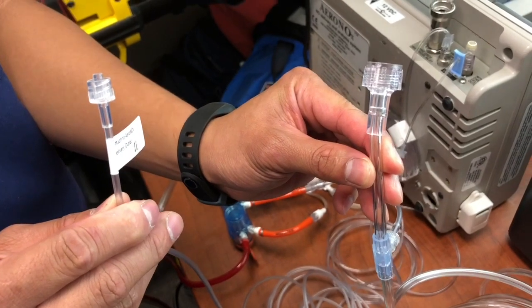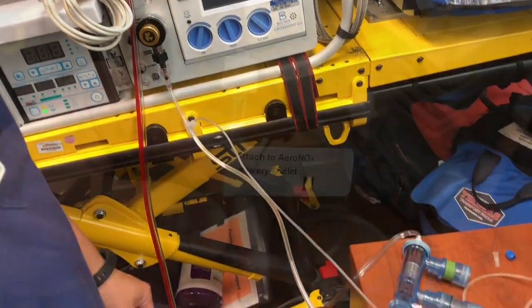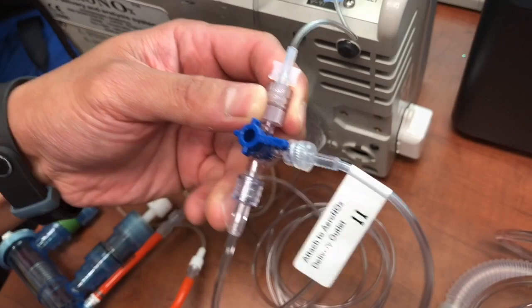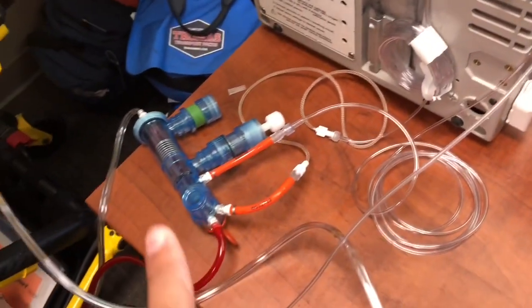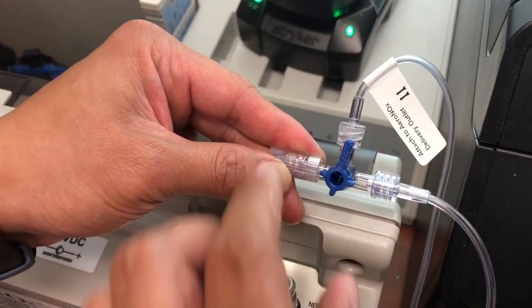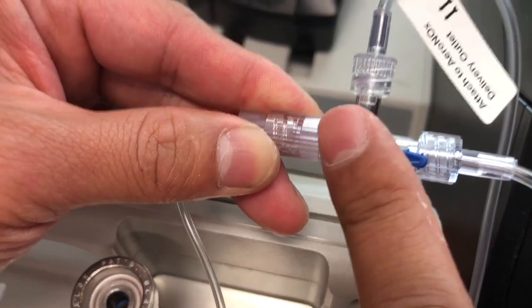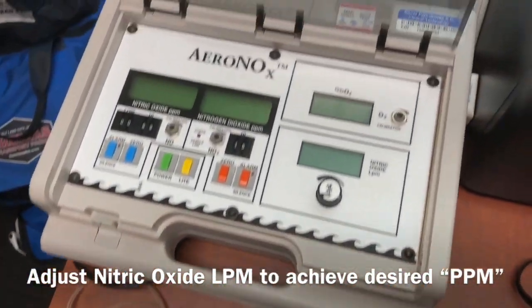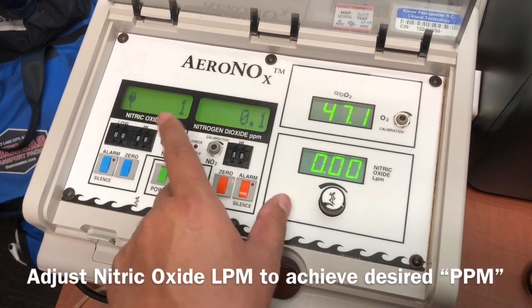This is your Arnox Bagger. First, hook it up to your flow meter, then connect the other side to the Aranox delivery line where the T is. Currently, nitric oxide is being delivered to the patient. If we want to bag, we have our Arnox Bagger hooked up. You'll have to switch so that it's off to the patient and nitric will be delivered to this line. We've got our Broncotron on, and now we're going to fire up the nitric and adjust to achieve the parts per million we want.